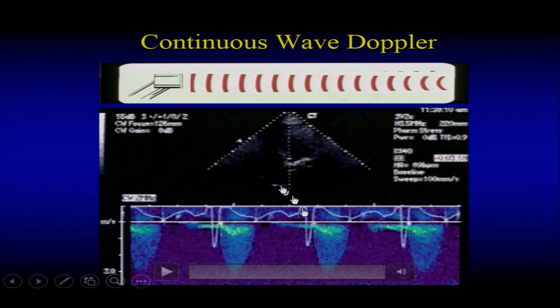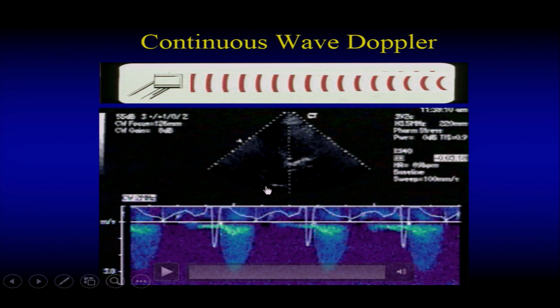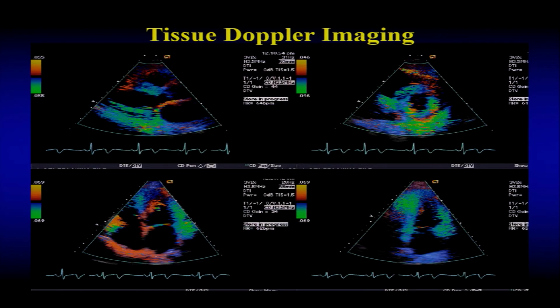To tell you the truth, it could be a subaortic membrane, could be the aortic stenosis, could be a supravalvular stenosis, okay? At times you see those kinds of things. At times all this is normal and you go from the suprasternal and there's some large vessel that is obstructed, etc. So you have to be careful making sure where things are coming from.